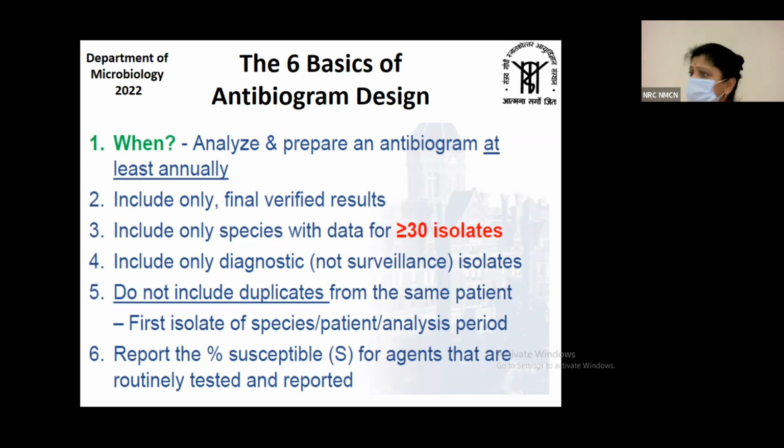Drains, tracheal aspirates, ET aspirates, all will give you only colonizers. Swabs will only give you colonizers. So treat the pathogen. Don't treat the colonizer. Don't treat the sample; try to understand the patient.